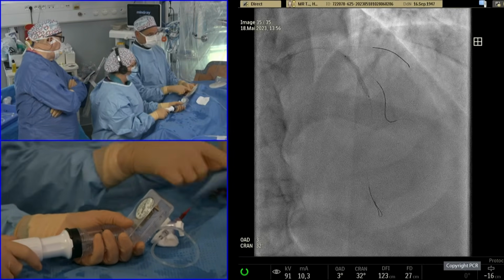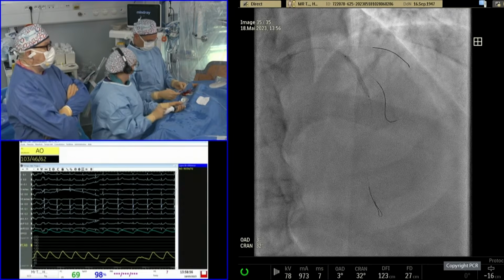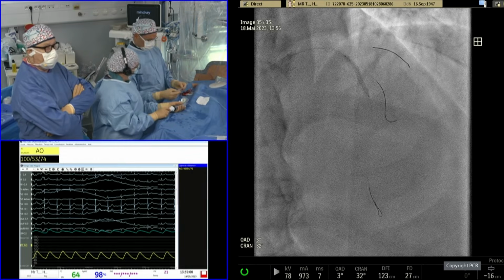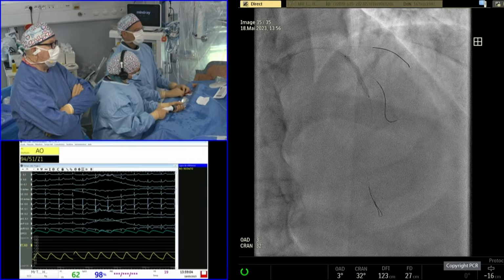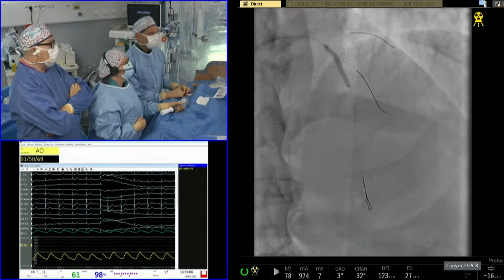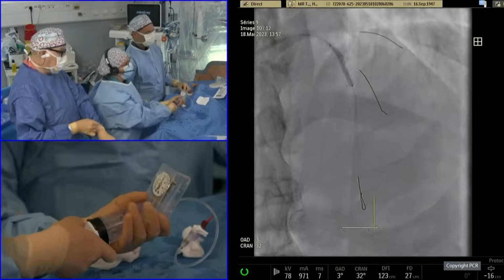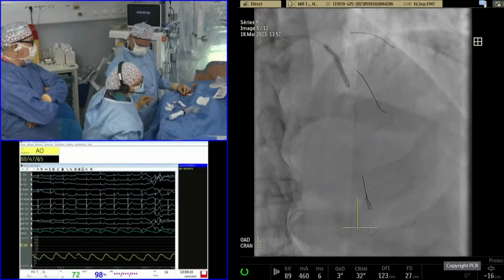But I'm sure that using 2 stents, 2 different platforms, you are able to have much more symmetrical strut distribution, better optimization, instead of striving to have 50 millimeter and having a risk to land inside the lesion. And lower the risk of carina shift for the diagonal. Exactly. Because if we put 3.5, then the risk is much higher.